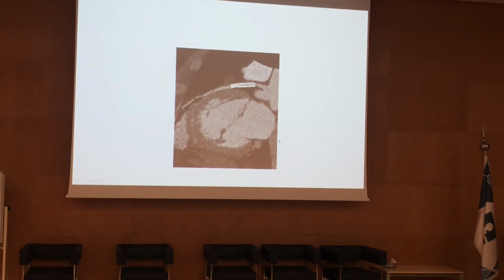Anybody can tell what's this? Excellent. So this is a 2-chamber view, and you can see this lady here, go to the apex, and there is a stent here which is patent. You can see the contrast inside it.